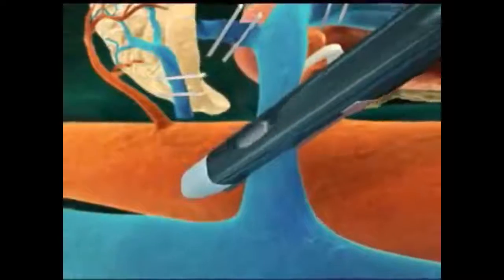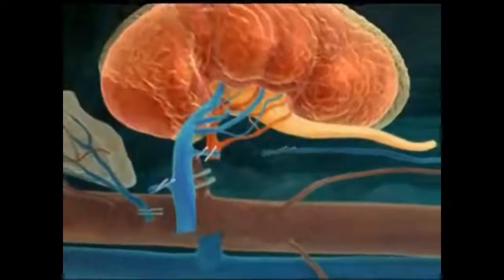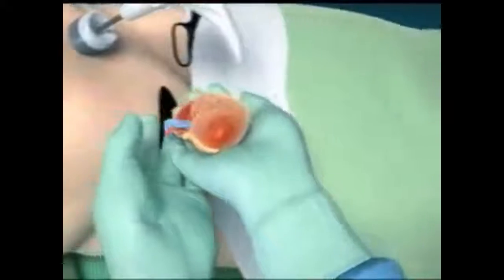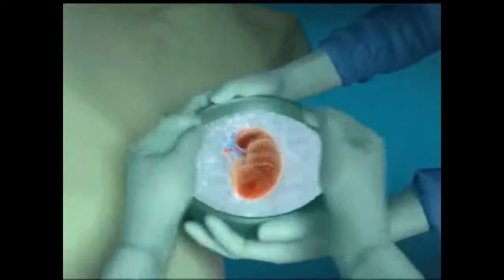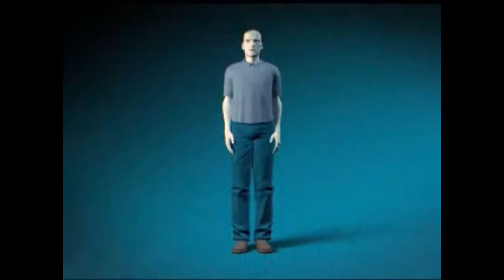The vein is controlled with a stapling device. Finally, the surgeon reaches in to retrieve the kidney through the bikini line incision. The kidney is immediately placed into an ice basin to help preserve the kidney for transplantation. All wounds are then closed, and the donor is recovered. The hospital stay is usually two to three days, and most donors return to normal activity by three to four weeks.